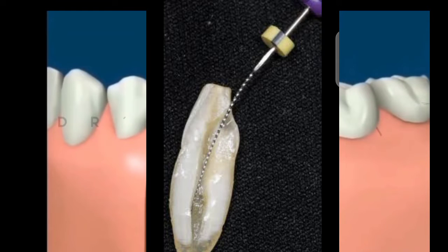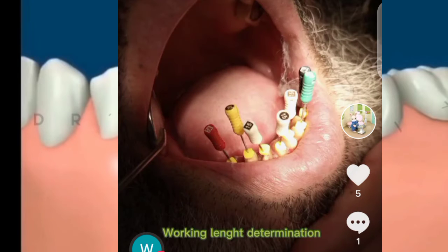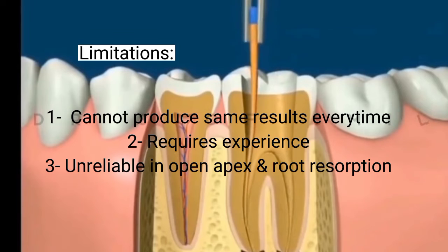Although it may appear to be very simple, its accuracy depends on sufficient experience. An experienced clinician may detect an increase in resistance as the file approaches the apical 2 to 3 mm. Afterwards, the confirmation may be done either by the radiograph or electronic method by using the apex locator. This method has few drawbacks. That is, this method is unreliable as we cannot get the same result every time. Also, it depends on the skill of the dentist. It is unreliable in open apex or root resorption.